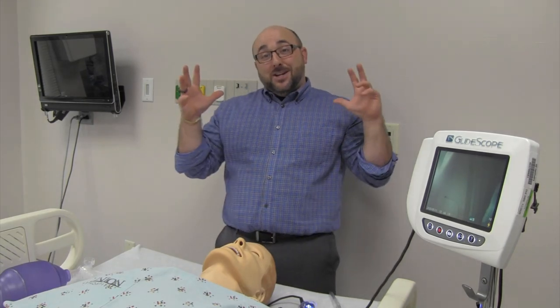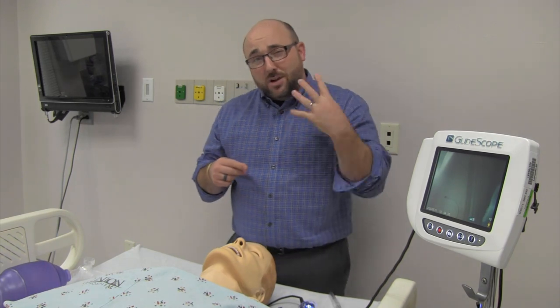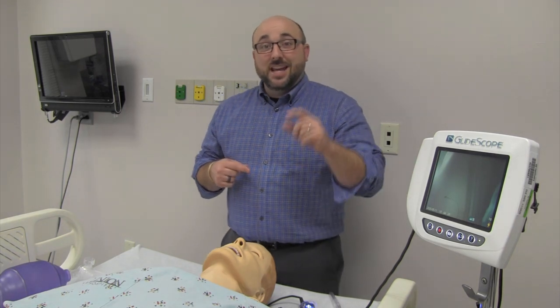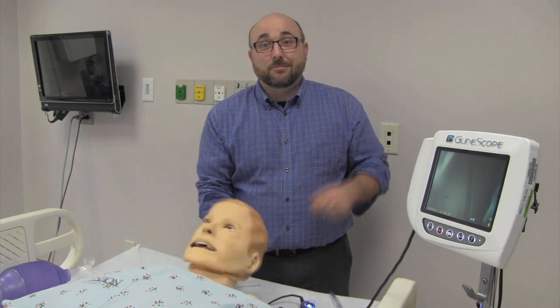What is up today guys, got a video today about the GlideScope. I have a four-step process for using it to make sure you do this correctly if you're using video-assisted intubation.